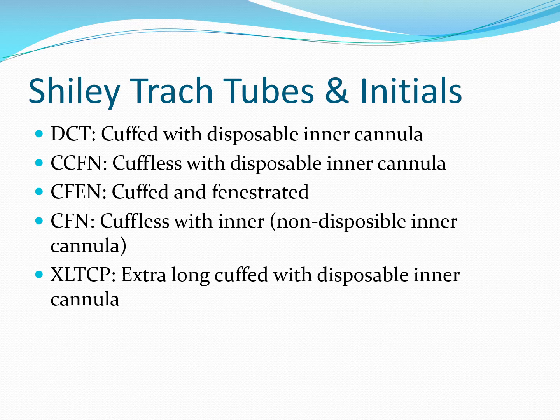I'm not going to read all these to you, but CCFN is cuffless with disposable inner cannula. CFEN certainly suggests that it's cuffed and fenestrated, the FEN being associated with fenestrated. And then the other ones that are listed here, and still others that aren't listed here, are much less common.